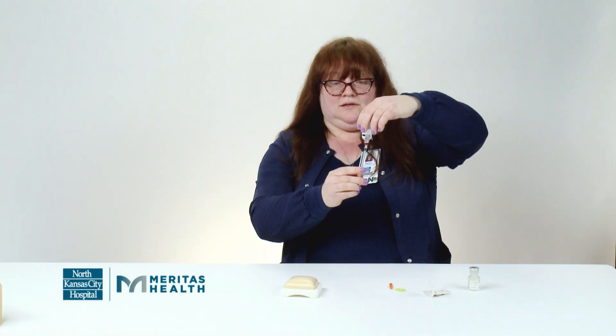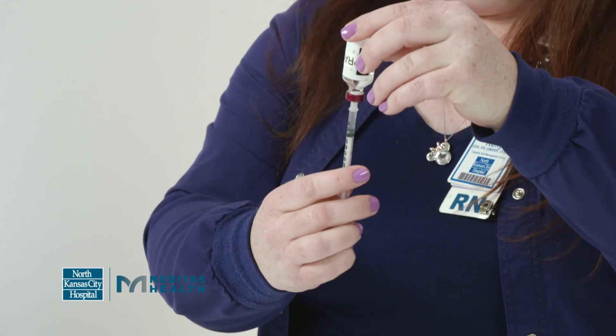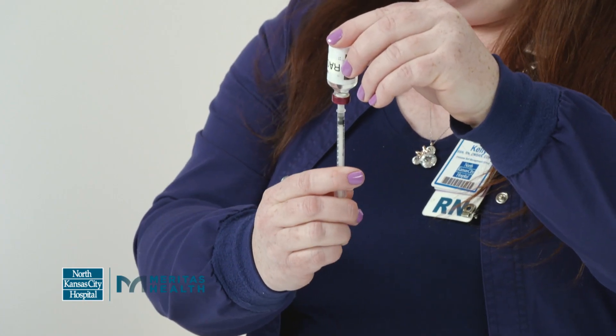Then you're going to flip the bottle over and pull back down to that dose, which was 15. If you notice air bubbles after you draw it up, you can push the insulin back in the bottle and pull it back down.